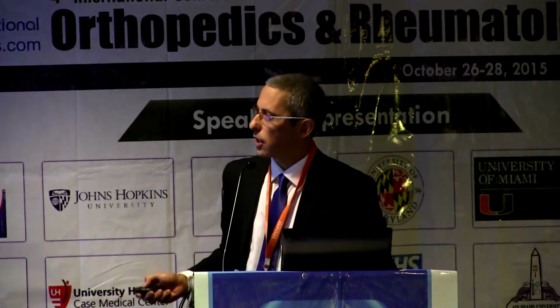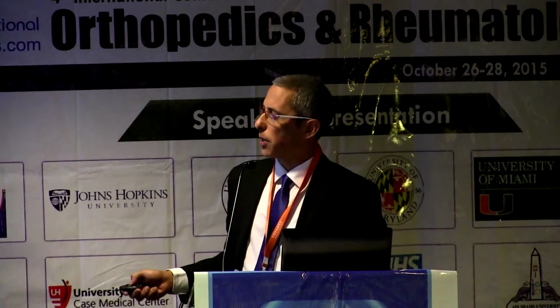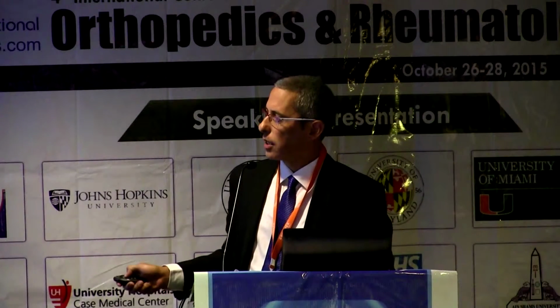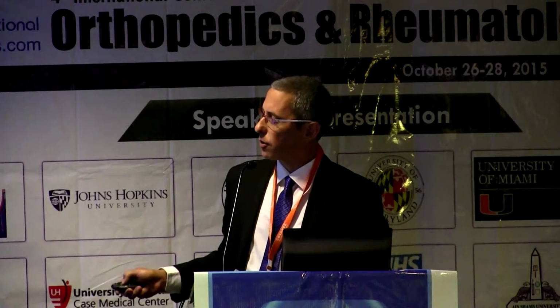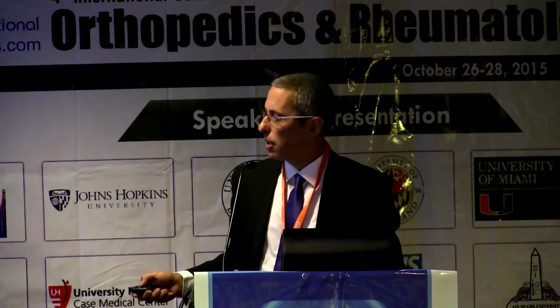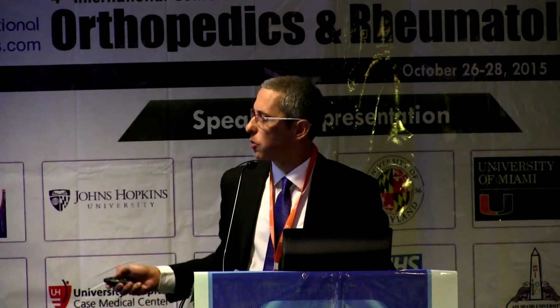As you can see here, that's the arthroscopy. We look from the back. On the left, you will be able to see the glenoid over here. That's the humeral head. This is the cuff. This is the cuff that's supposed to be over there. You try to pull it, it doesn't move. It's a chronic tear. This is a basically irreparable cuff tear. You cannot suture it back to where it's supposed to be.